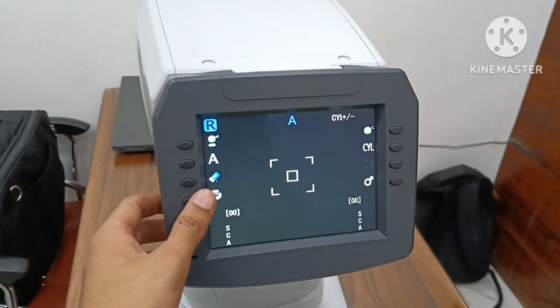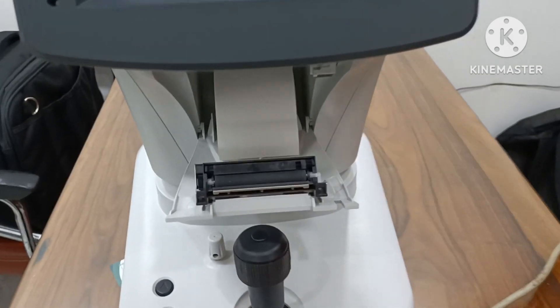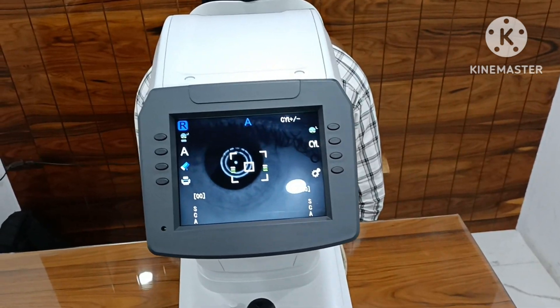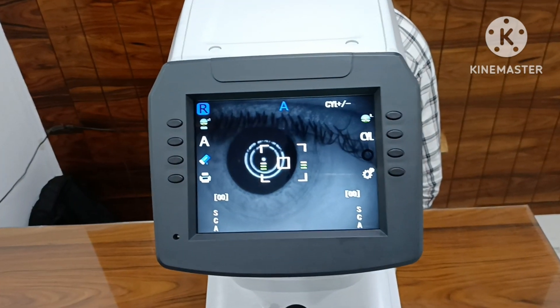Thermal paper printer inbuilt. Now I am taking a reading. Here three dots are visible, which means the target is not clear.